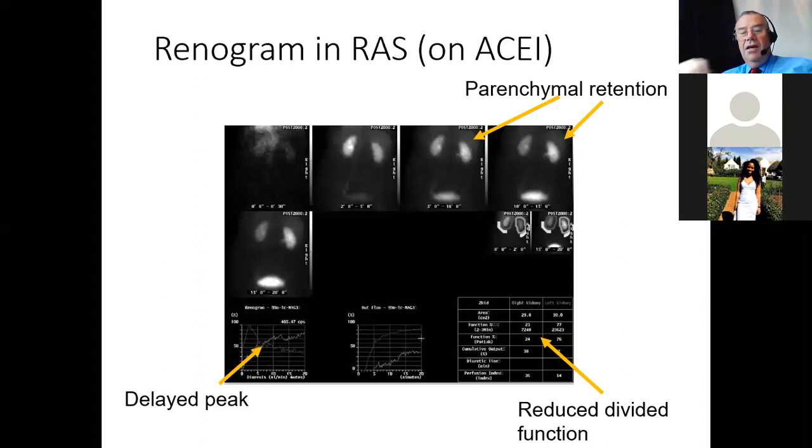So this is a positive study. What we've got here is a peak that's delayed. You can see that's because there's parenchymal retention of activity on this side. Now, this is not an obstructed kidney.